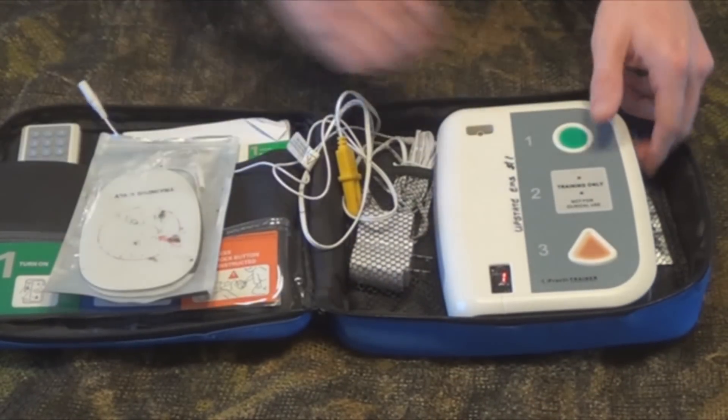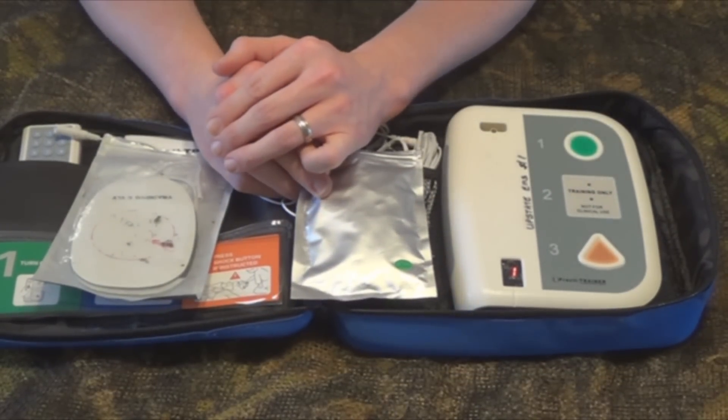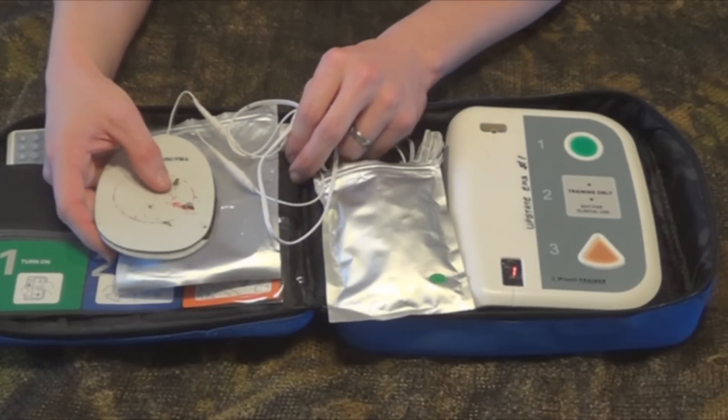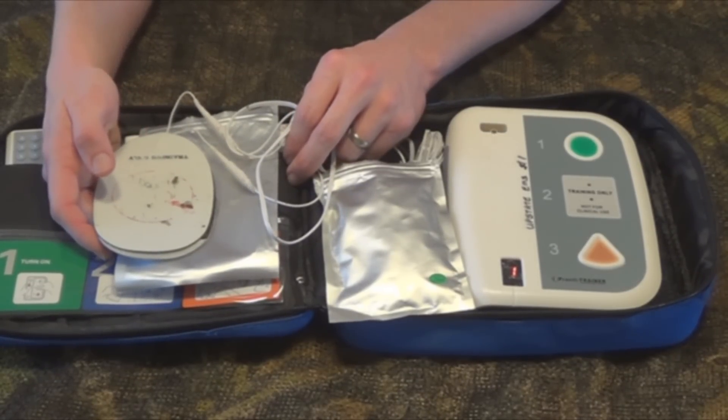Most AEDs typically come with an adult set of pads and a set of pediatric pads. All pad placements are different, so you really have to look at the picture to see where they want the pads placed.